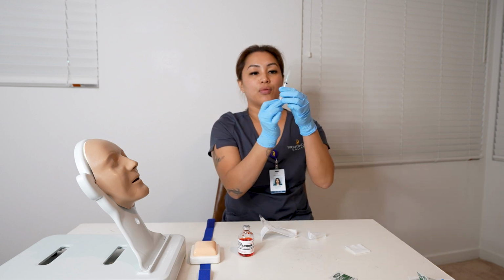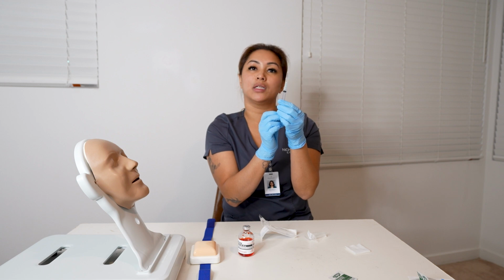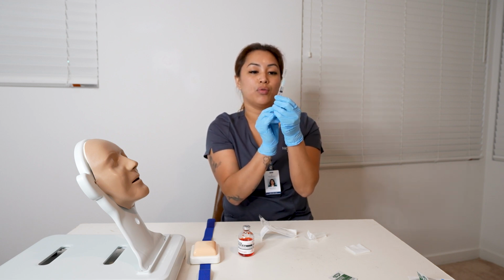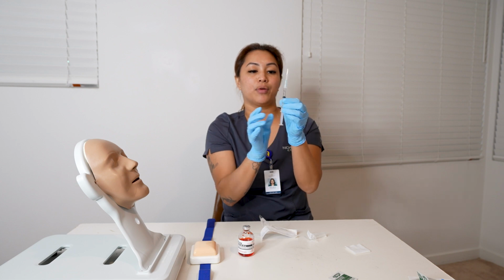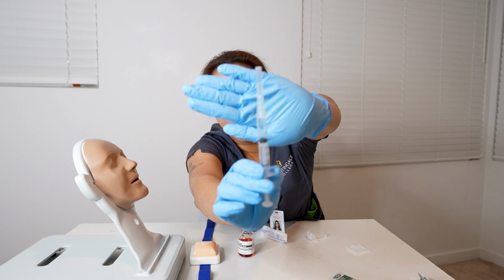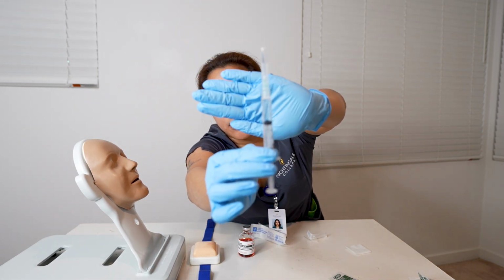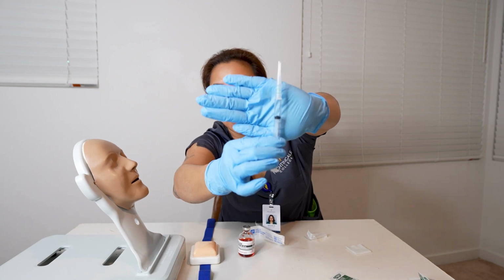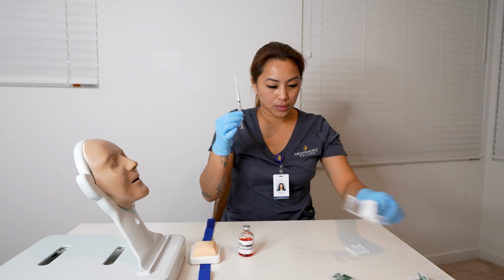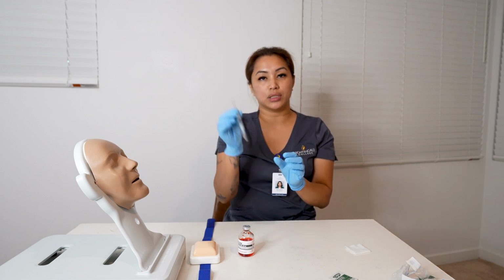Perfect. So now we are going to draw 1.5 milliliters of air while the cap is still on. So 1.5 milliliters of air. Perfect. So now I'm going to just show you guys. 1.5. Okay. Just put that away. So 1.5. So now I am going to hold it like a dart.